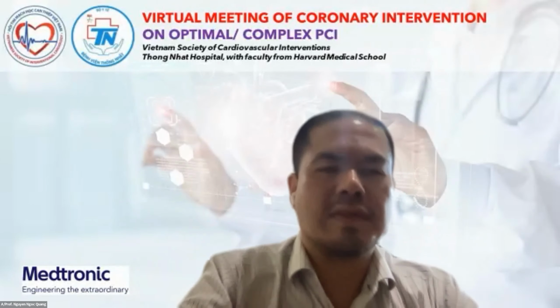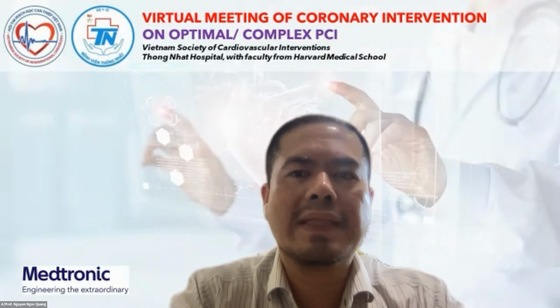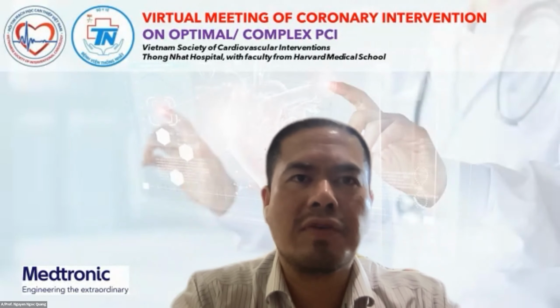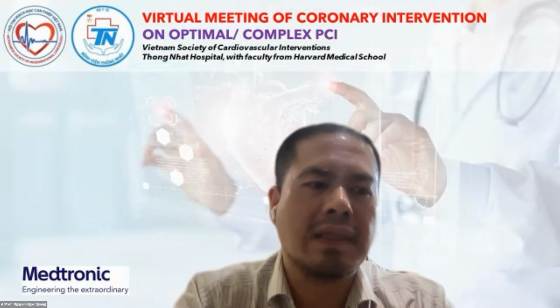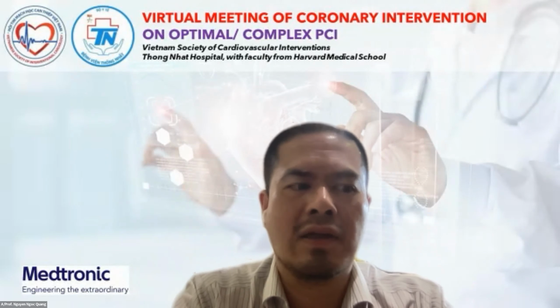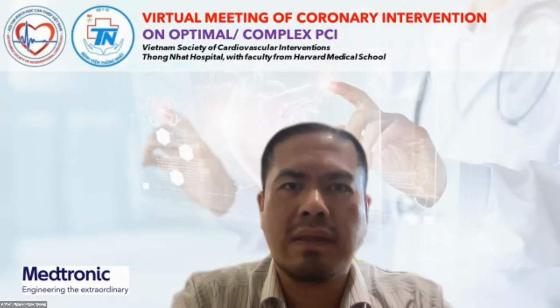Thank you very much for your presentation. Although we don't see the complete presentation, I think Professor Merton already mentioned a lot of things involved in the role of intravascular imaging for complex PCI. I think one thing that is important for reality is we have a few things like IVUS and OCT. And even for the IVUS, we have a lot of IVUS available in the market.